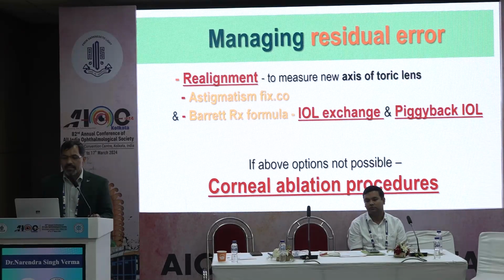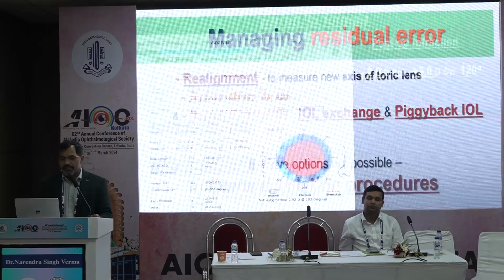These are the options to correct the residual error: realignment; if realignment is not possible, IOL exchange or piggyback IOL. If you have access to a LASIK laser, then you can go for a corneal ablation procedure also.